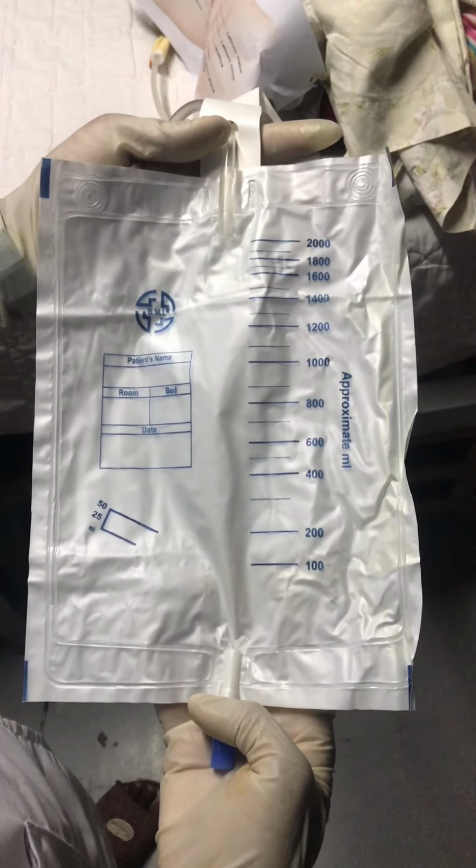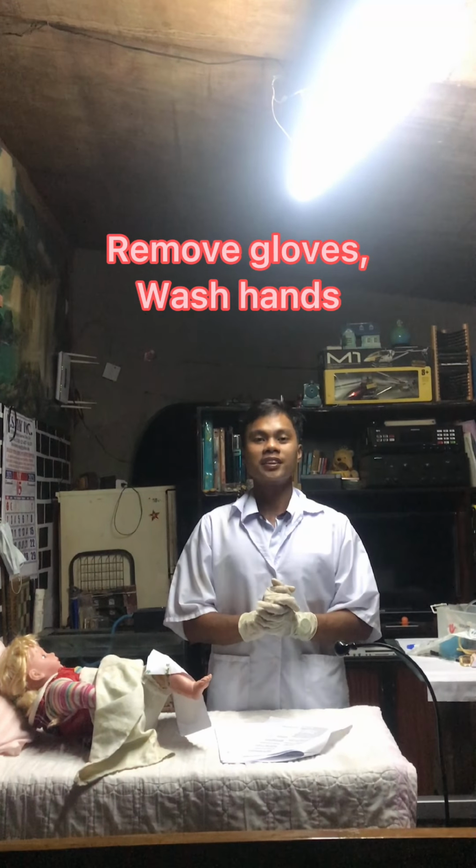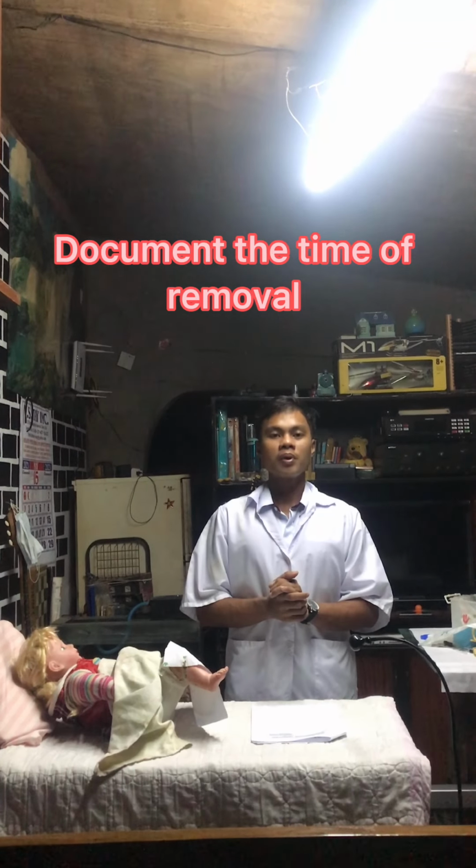Measure the output in the drainage bag and record the output on the input and output sheet. Empty the urine into the toilet bowl and dispose of the urine bag into the yellow bin. Next is remove gloves, wash hands, and make the client comfortable. Then instruct the client to drink extra fluid. Then warn the client that there will be a mild burning sensation during the first void. Lastly, document the time of removal of the catheter. A careful record is important for documenting the data for the client's care.